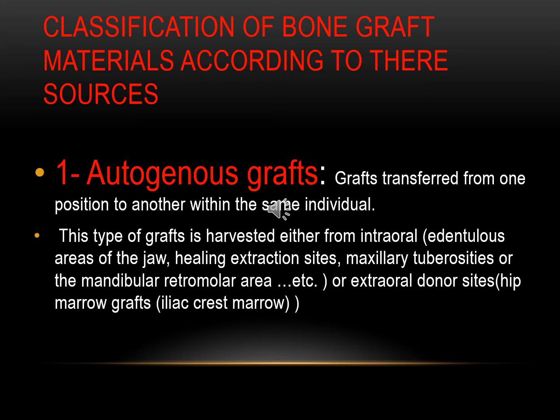This type of graft is harvested either from an intraoral location or from an extraoral location.